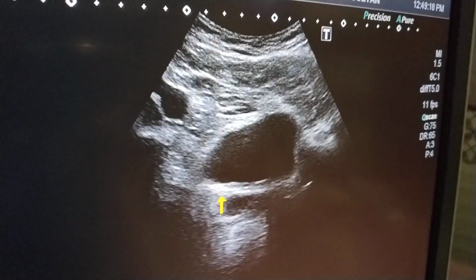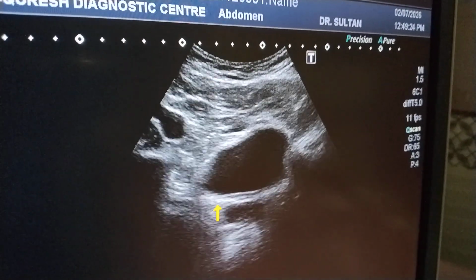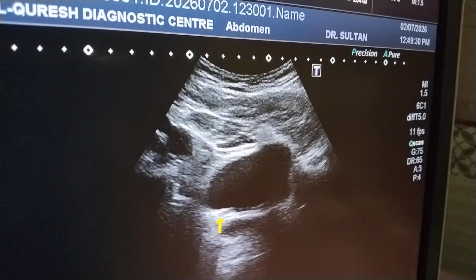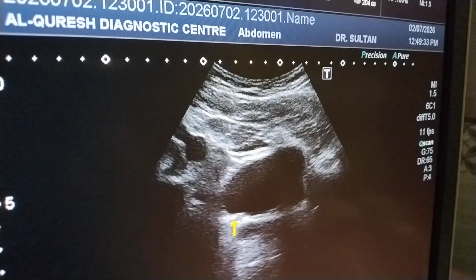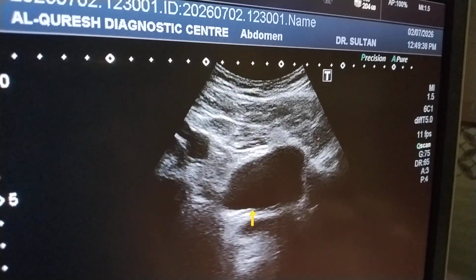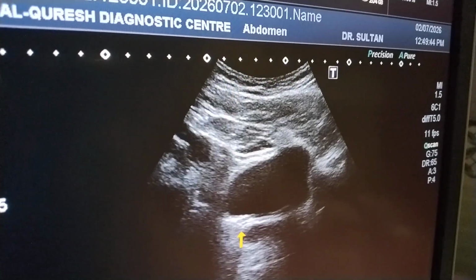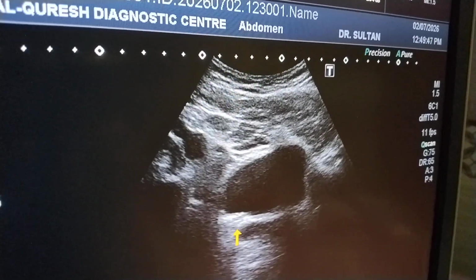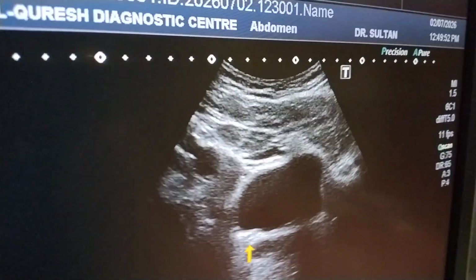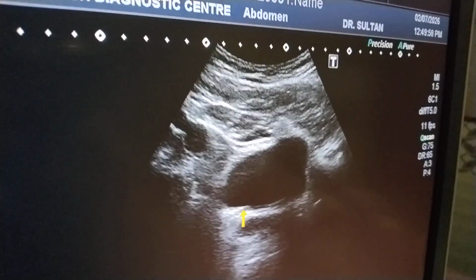And here, as we know, this is a ureter having smooth muscles, so there are two layers in the upper two-thirds of the smooth muscles. One is longitudinal, the inner one, and then the outer layer is circular. And when it reaches the lower third, it has three layers. An extra layer is present. The inner one is longitudinal, then the middle one is circular, and then the outer one is again longitudinal.